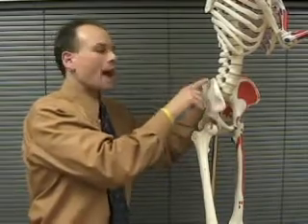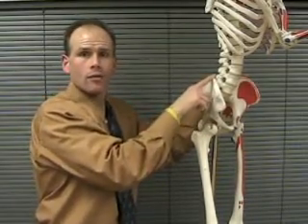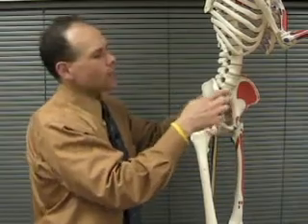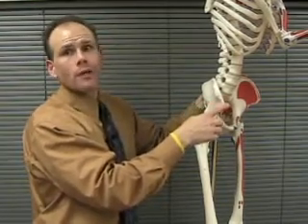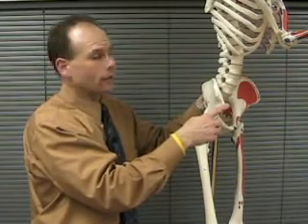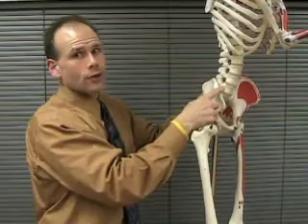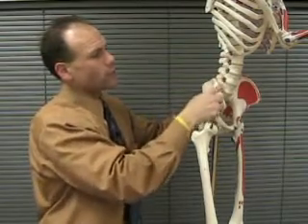Often this site is taken too far either back on the iliac crest or too far forward near the ASIS, or the anterior superior iliac spine. If you're that far forward, you're probably beyond or too far forward of the anterior axillary line. So you should be about anterior axillary line from the armpit, 2 centimeters above, an oblique fold.